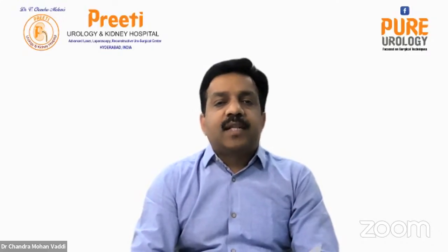The prone PCNL has been there for the last 30 years because most of the teachers and students followed the same and it continued. But after RIRS picked up, suddenly the supine PCNL has come into the picture because you can combine both. You can go through the flexible scope. If you have a large load of stone, you can do supine PCNL in the same position without changing anything. The primary position for RIRS and for supine PCNL can be the same. That is endoscopic combined intrarenal surgery. It may be done the other way also, prone, with simultaneous bilateral endoscopic surgery also.